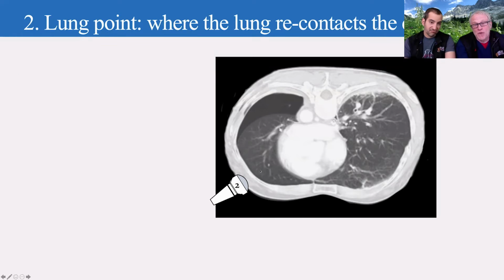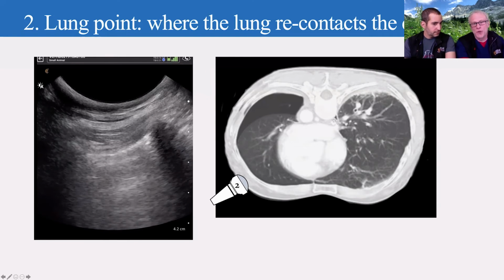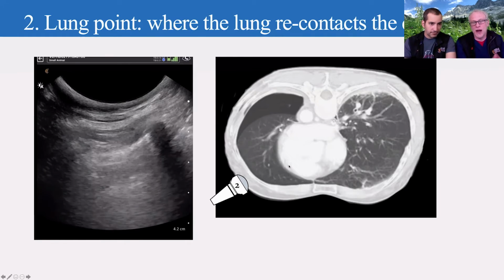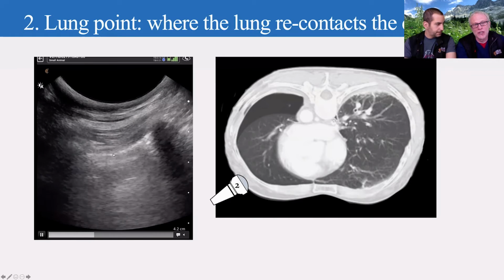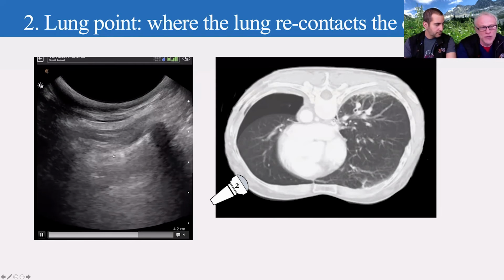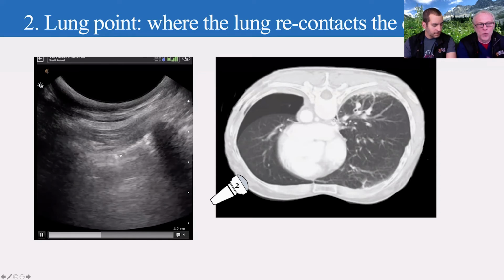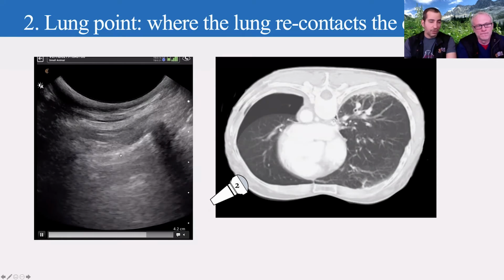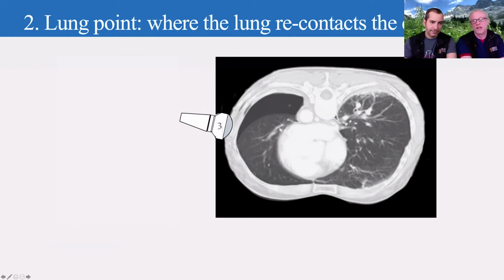All right, so what about if we move down here? Well, if I come down here, I'm over lung, so I should see everything like I normally do. And when my patient breathes, even though I have a pneumothorax, that lung's still going to expand and contract. Therefore, I am still going to get movement of that lung along that chest wall. I'm still going to get a shimmer, lung sliding. And if I look at this image here where my little pointer's at, do you see that back and forth water-like shimmering, Dr. Chalhoub? I sure do, Dr. Boysen, all the time.